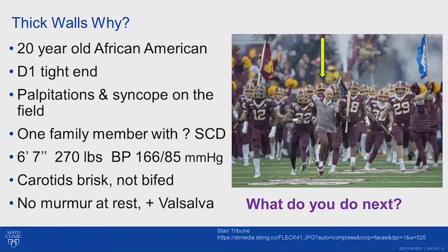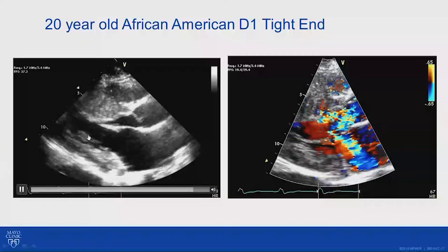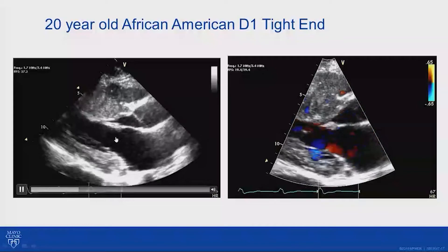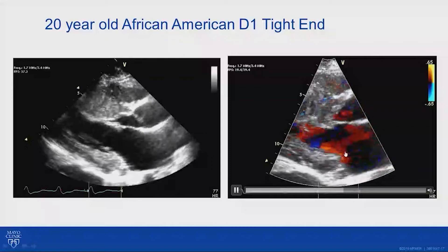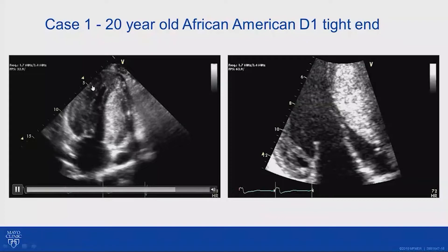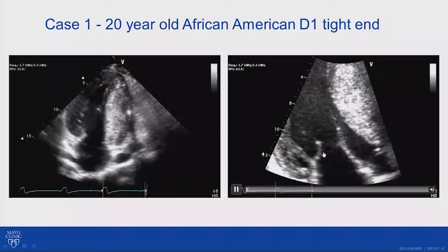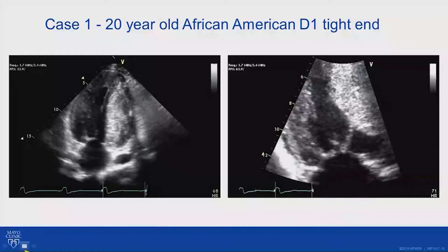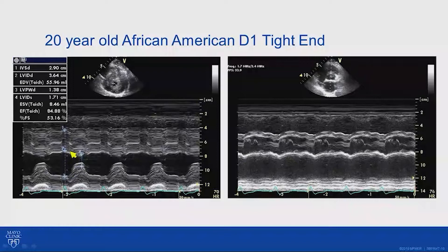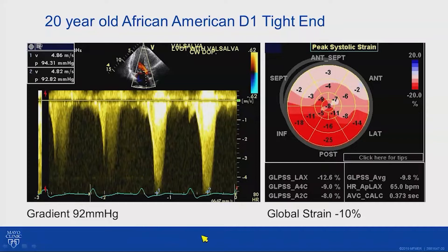His echocardiogram shows clear asymmetric septal hypertrophy with systolic anterior motion. With color Doppler, you can see the turbulence in the left ventricular outflow tract and the posteriorly directed jet of mitral regurgitation. He's hypertrophied in many walls but with asymmetric septal hypertrophy. His left atrium is not significantly enlarged. His walls are quite thick — almost three centimeters. You can see the fluttering of the right cusp and mid-to-late premature closure of the aortic valve. With Valsalva he gets a gradient of 92 mmHg, and he has significantly reduced strain on the bullseye pattern.